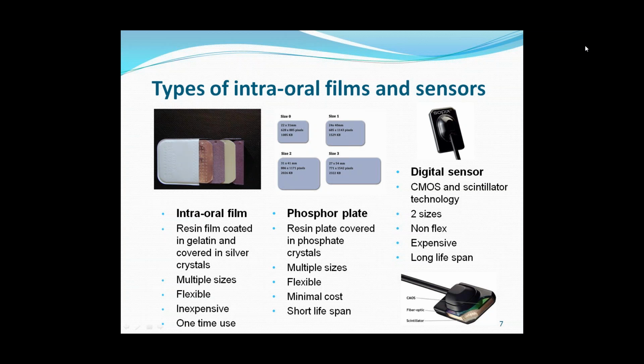So for a beginner or a novice who is taking radiographs for the first time, one of the advantages of the digital sensor is that it stays in place in the mouth, so if the image isn't perfect, you just need to move the tube head or the sensor slightly, and it's very fast, so you can take multiple radiographs until you get the right one. Versus if you were to have a phosphor plate, you've actually taken it out of the dog's mouth, and therefore the chances of you putting the plate back into the same position are quite high. So you could end up with the same radiograph again.